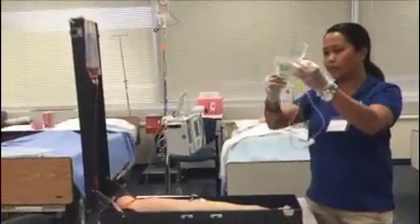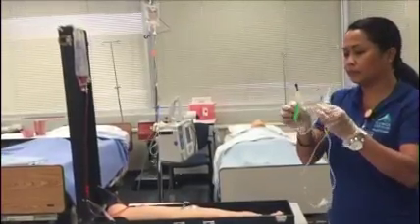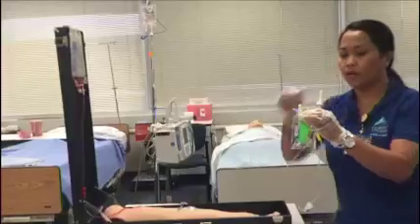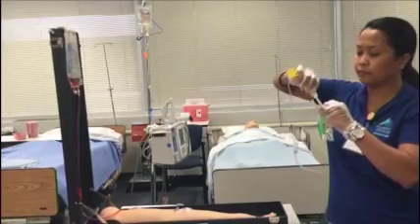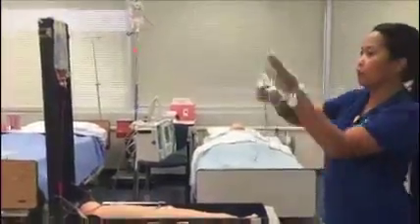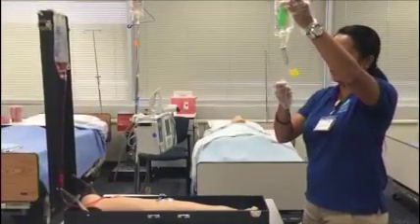Getting this, I'm going to stab it. All right, this is trash. Stabbing it. All right, this is on, and I'll make sure this is clamped.